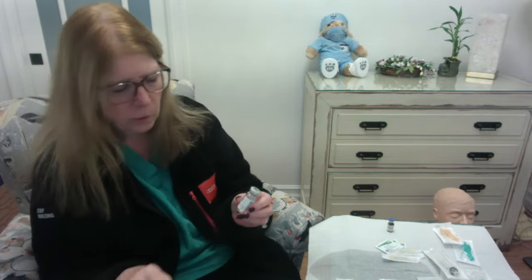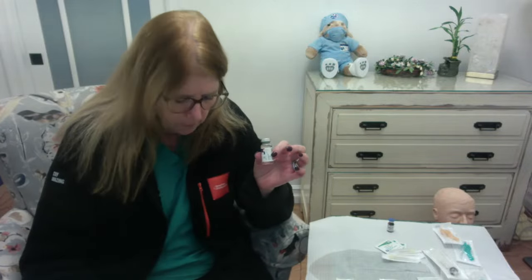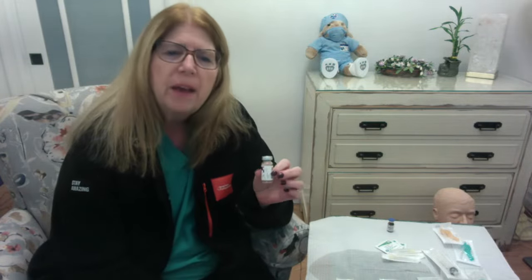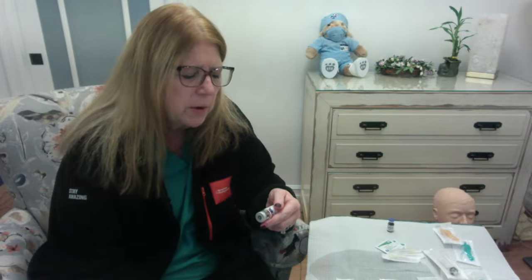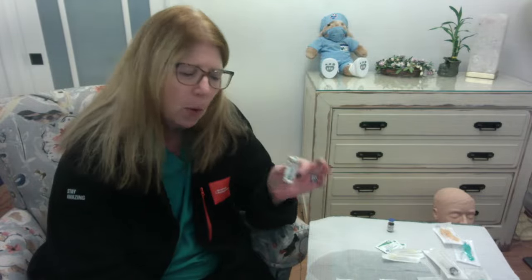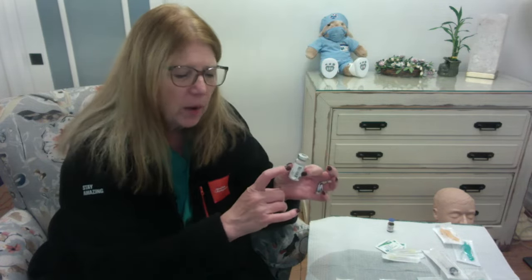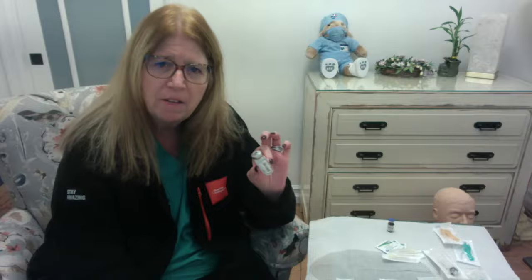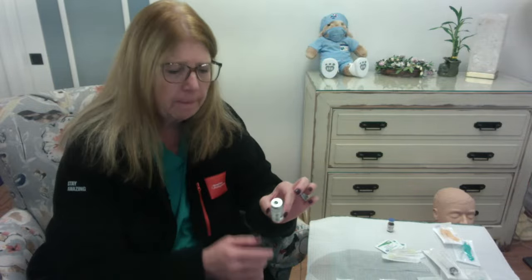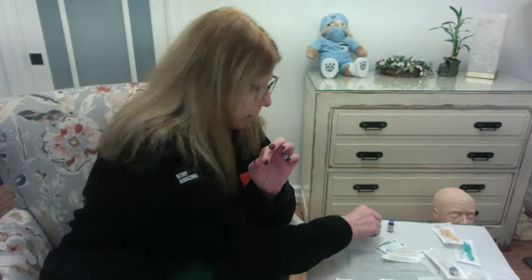So these vials, when they are multi-dose vials, keep in mind the expiration date. So this vial has an expiration date of February 2029. But once this is opened, it's only good for 28 days. And that is the reason why we need to label it when it was opened, right? So that we know when it has to get discarded. So whenever something gets opened, we don't really pay attention anymore to the manufacturer's expiration date, okay? All right, so that's taking our medicine out of vials.